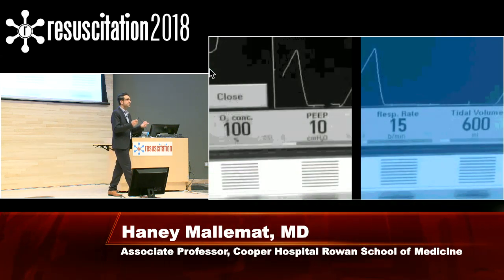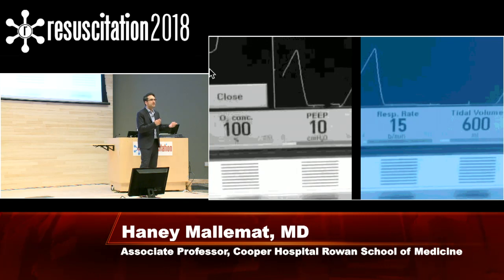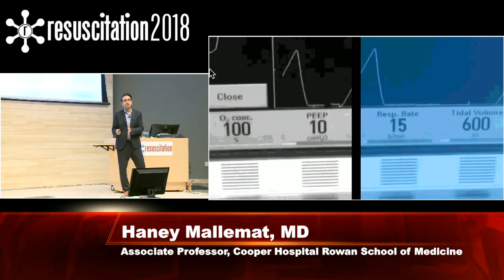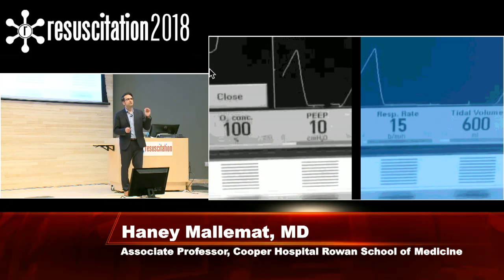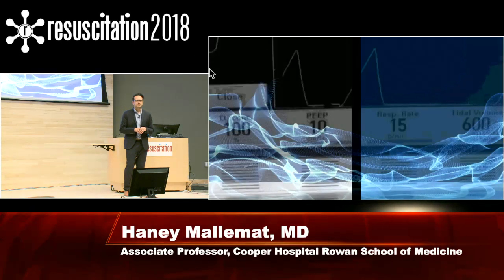When you get that patient who you intubate and you're looking to see what can I do to make them better, these are the variables you're going to adjust. If they're hypoxic, increase their PEEP first. And if they're having respiratory acidosis, the stuff you do every day, crank up the ventilator, crank up the tidal volume. Try not to exceed 8 cc's per kg.